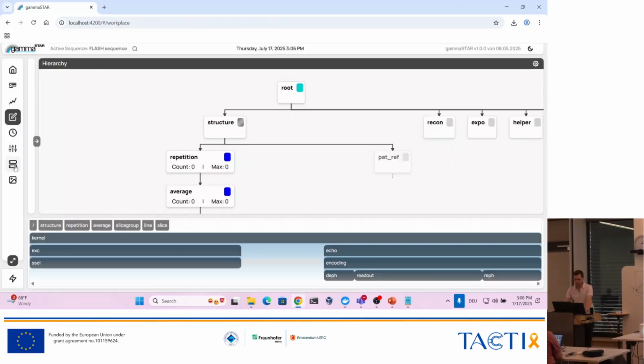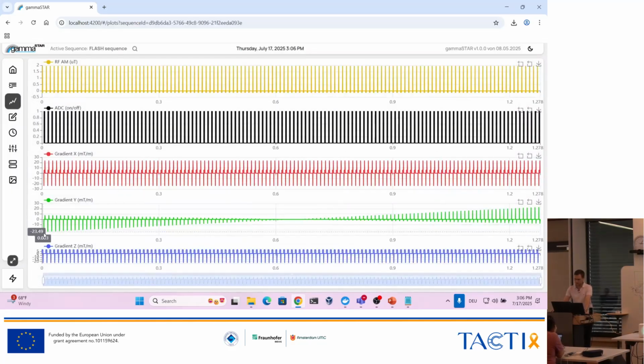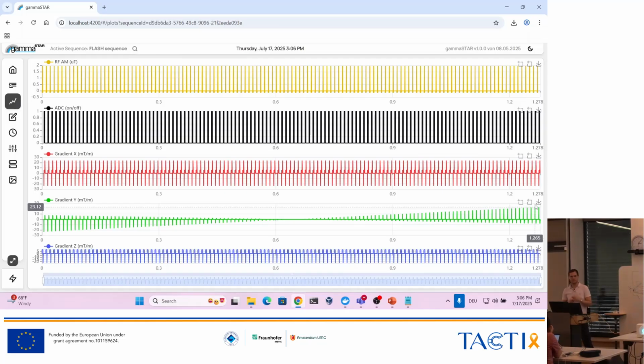And if you look at the whole sequence, you actually see that you start in a negative direction, you end in a positive direction. So going from zero, so the center, start here, end up here, and with each excitation you get one line readout. This costs some time because you only with each RF excitation can acquire exactly one line of K-space. Yes? Can I ask a question? Sure. What was the function of the last pulse in the red column? Yeah, that's a spoiler gradient.